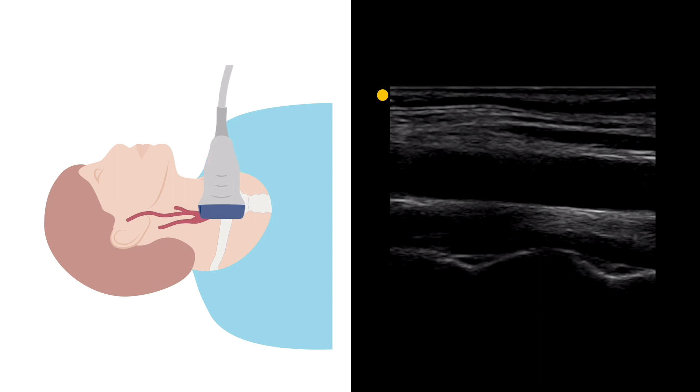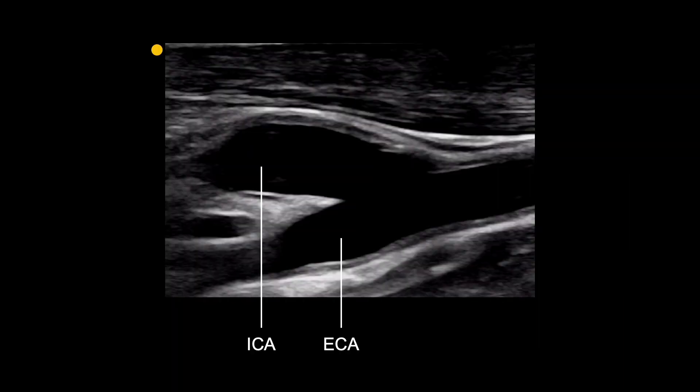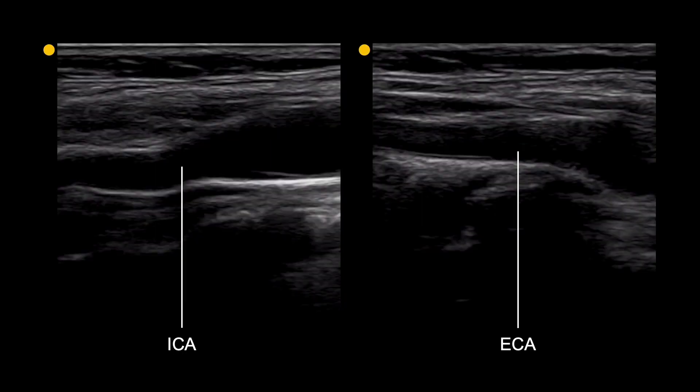Move up the neck using the knowledge gained from the transverse scan to help orientate the probe as you go. In some cases it will be possible to image the bifurcation with the internal carotid artery and external carotid artery in the same plane, but they will often have to be imaged separately in a different plane. These two vessels usually lie very close together so only small movements of the probe are required.